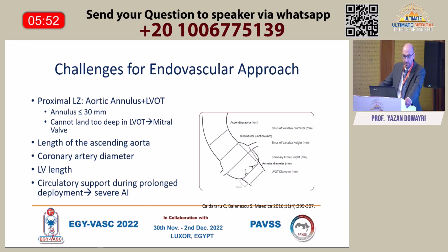The coronary artery diameter for use with covered stents is a limitation. 5 to 6 millimeters is usually, from our knowledge with renal artery treatment with fenestrated and branched endografts, a small diameter for patency of the covered stents.